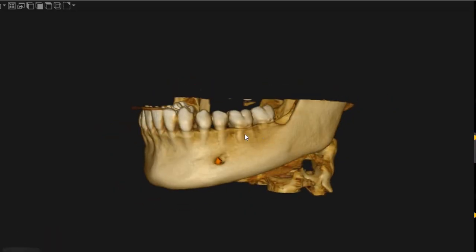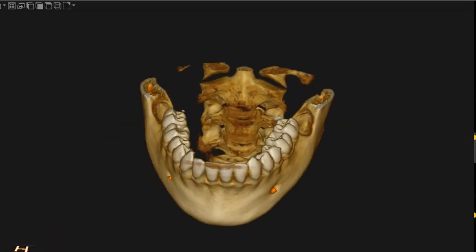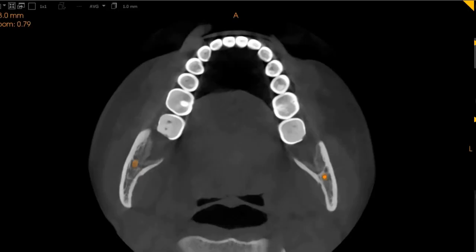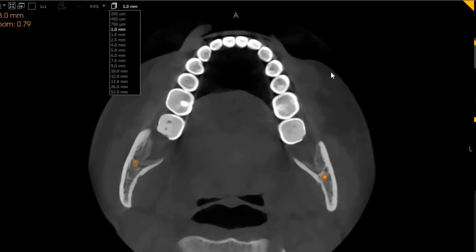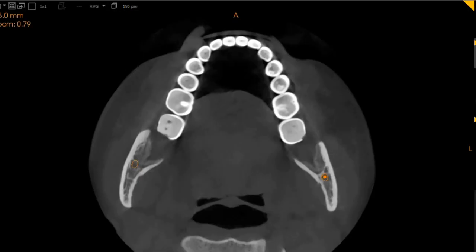Hello and Asalaam alaikum. I'm from Scan Diagnostics. Today this is the CBCT of the patient that you had requested. The area of interest is the lower right and the lower left 6s for evaluation.